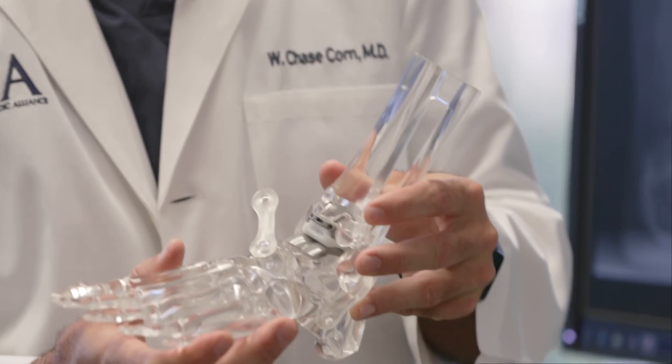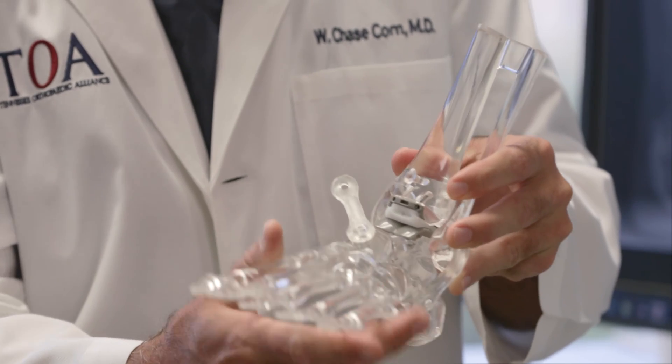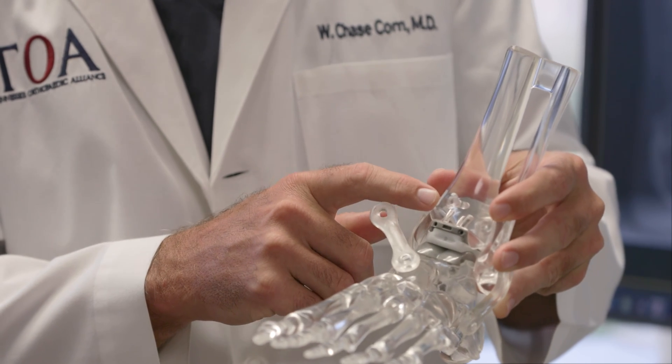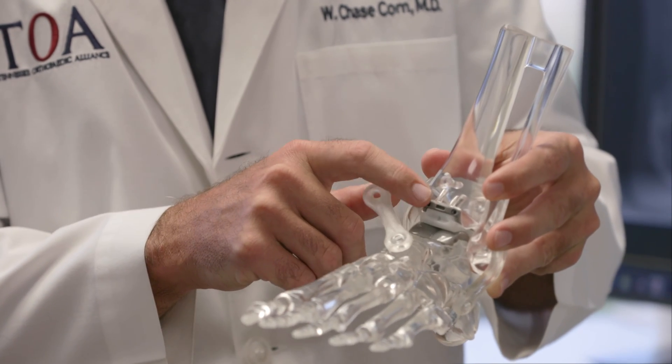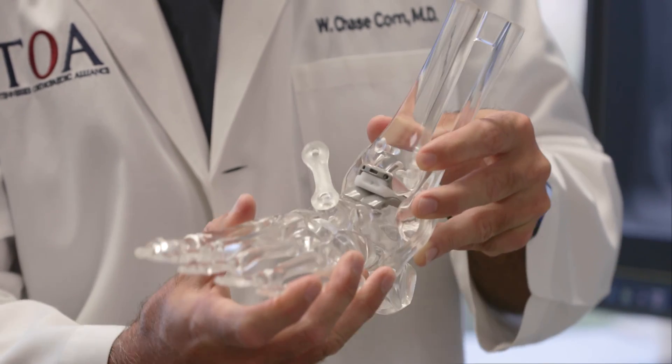This is what a total ankle replacement looks like. This is the talus bone — that's the bone in the foot that moves up and down in the ankle. And this is the tibia bone. In an ankle replacement, we replace the damaged bone and cartilage with metal parts, and there's plastic in between to allow them to move smoothly.